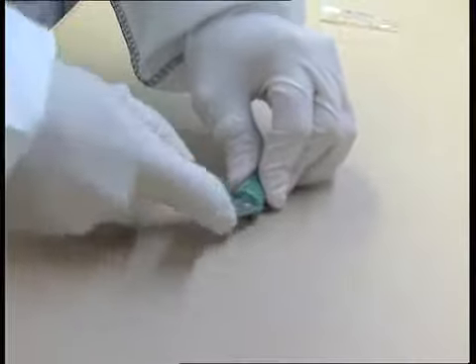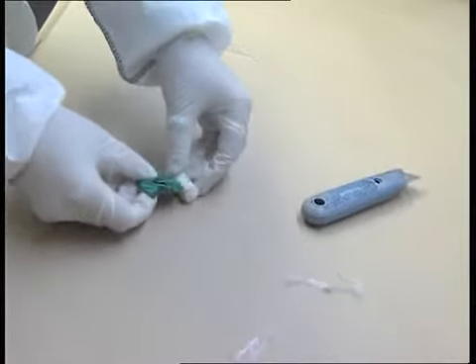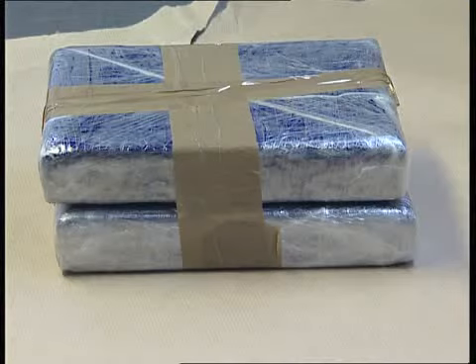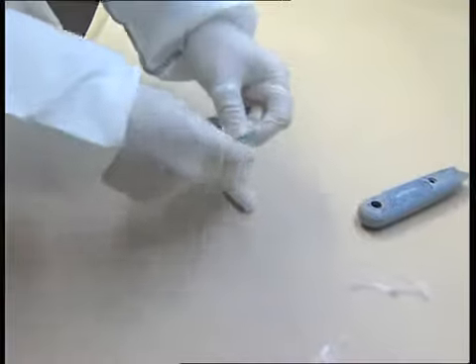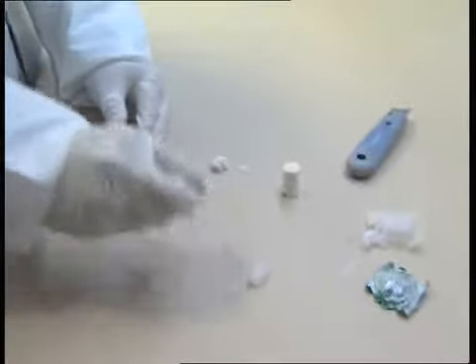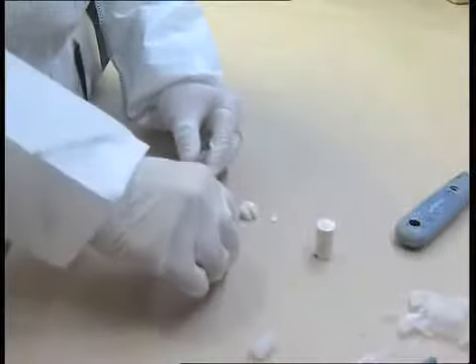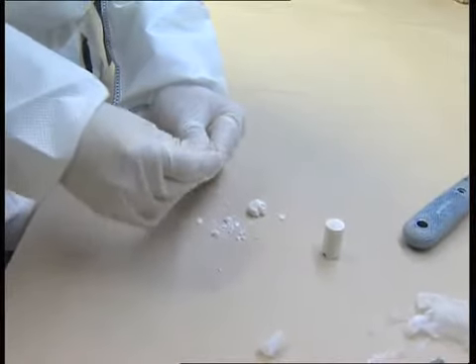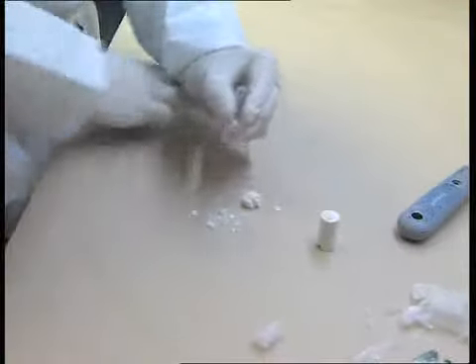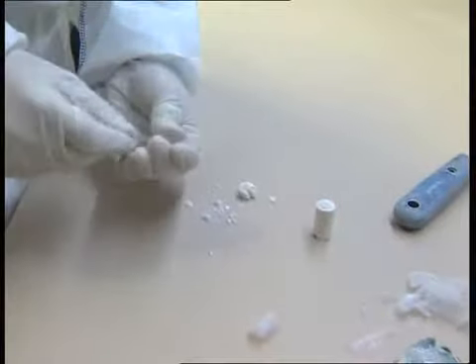A customs officer tests one of the swallowed packets by means of the cocaine test, recorded at one of the largest European airports, which has already been using the M.M.C. test for many years. In order to accelerate the reaction, a spatula is used to mix the substance with the granules. The blue discoloration indicates the presumptive presence of cocaine.